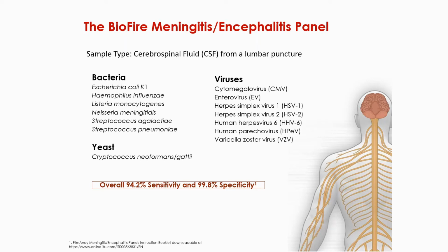The key issue is that you have someone who has a clinical symptomatology of meningitis. You clearly have white blood cells on the CSF. You feel this patient clinically has meningitis. The BioFire panel pathogen identification is negative. All we can say is it's not these pathogens. It must be something else, and we have to look elsewhere. And I really want to stress that very significantly. A negative panel doesn't mean they don't have meningitis.